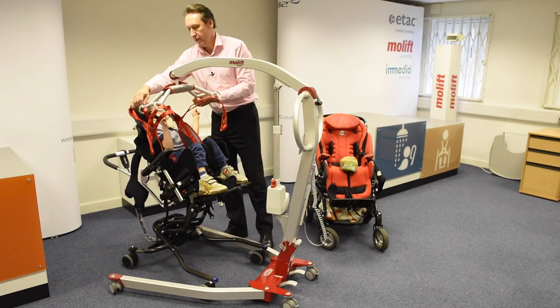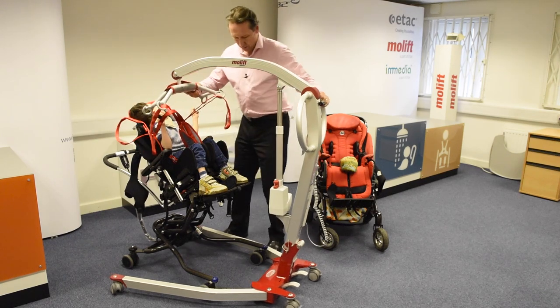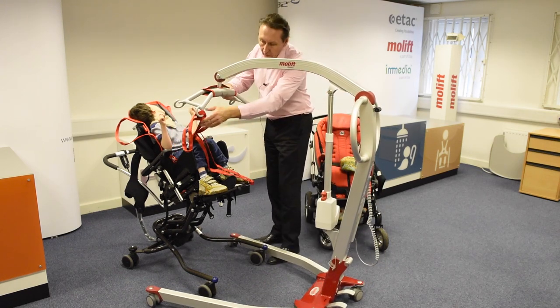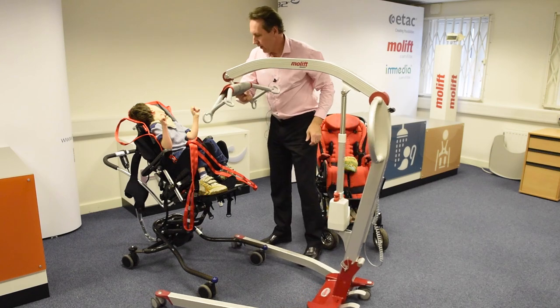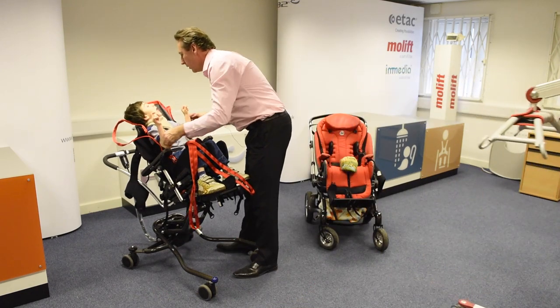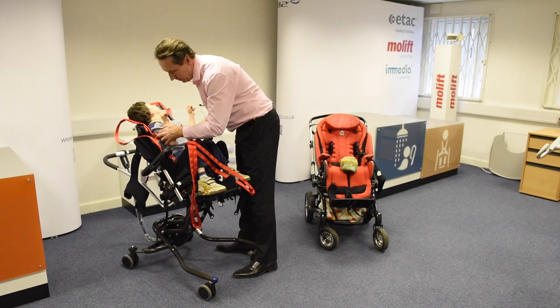You can move the hoist away, like that. And then we can get you securely positioned in your chair.